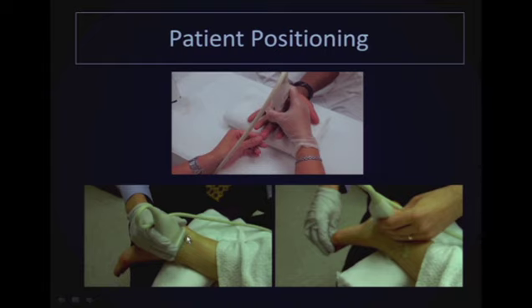For the ankle, it's easier to follow the medial and the lateral tendons when the patient is prone and the foot is off the edge of the bed. And we can also perform a dynamic maneuver or dorsiflex or plantar flex the foot if it is extending off the table.